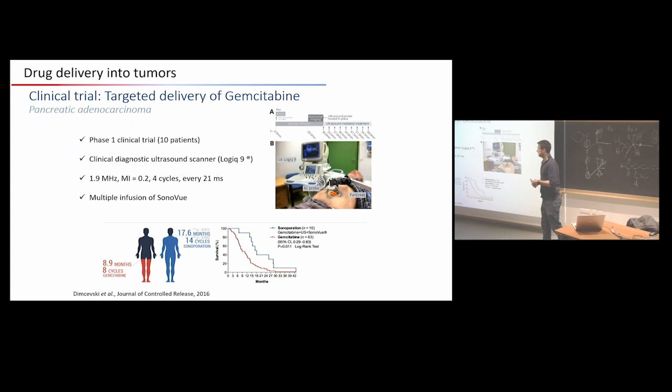They have also started some clinical trials, and this is the first clinical trial, published in 2016. This one was in Norway with 10 patients. And to go fast, because I told you at the beginning that we were not able to use therapeutic ultrasound with a clinical scanner, in fact, this is almost false. In that case, they used a General Electric scanner, and they used the contrast agent SonoVue microbubbles that are approved in clinic for imaging, not for therapeutic application. And what they have done here, they just tried to apply the most powerful sequence in an ultrasound scanner.